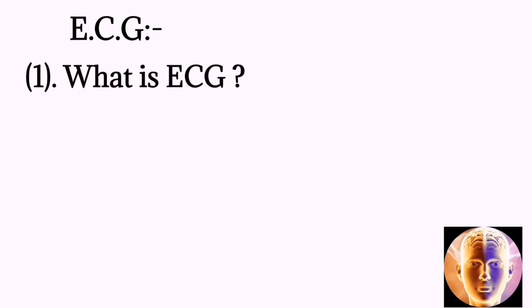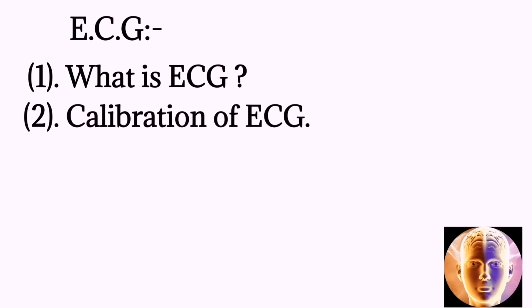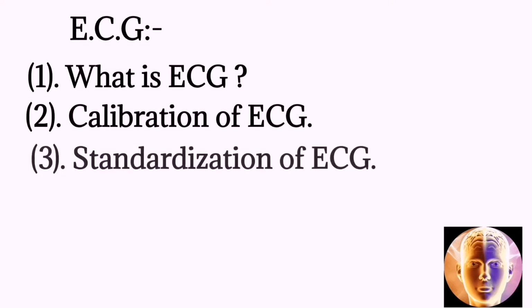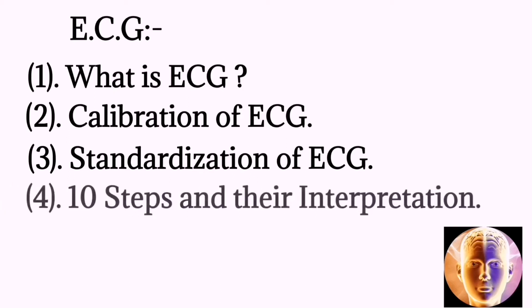Hello friend, in this video I will teach you ECG under the following headings. What is ECG, that is the definition of ECG, calibration or normal measurement of ECG, standardization of ECG, and 10 steps to interpret ECG. So let's start.